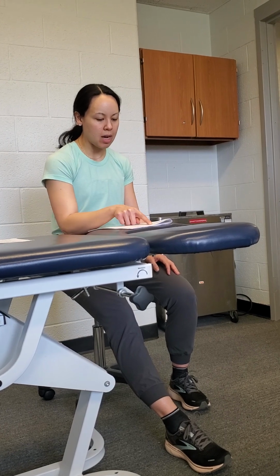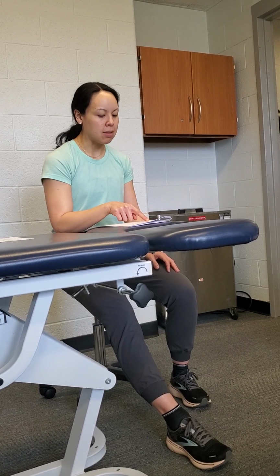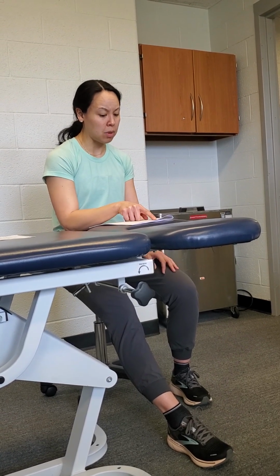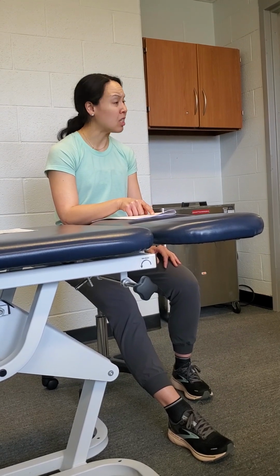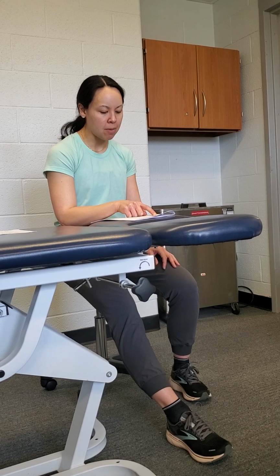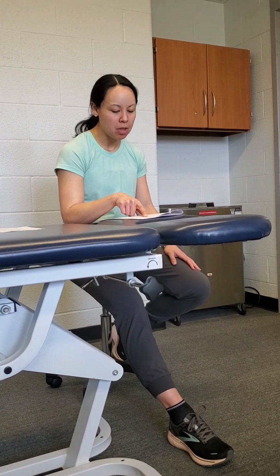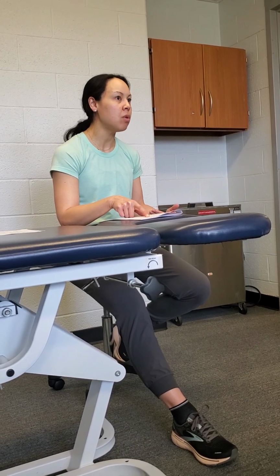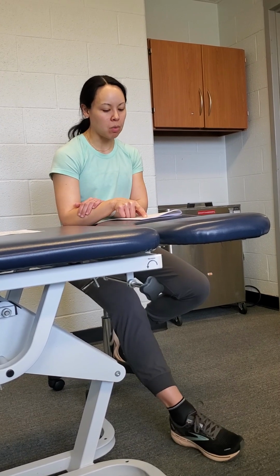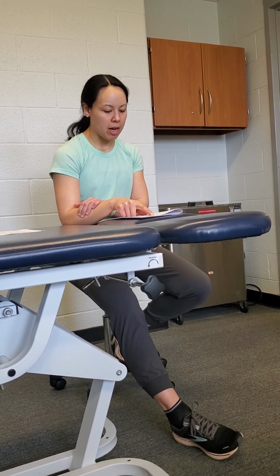I won't read this out to you guys, but here are the parameters that were recommended from that study. If you're doing it in the clinic, this is what you'd set the frequency, pulse, and intensity to: 10 seconds on, 30 seconds off, a little bit longer recovery time. Then you would combine that with the BFR, and the goal would be to do that twice a day, which is not necessarily clinically possible, but at least 2 to 3 times a week if they're getting it once with you. That's better than nothing, certainly.